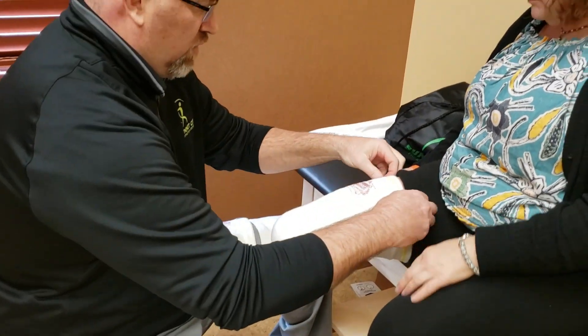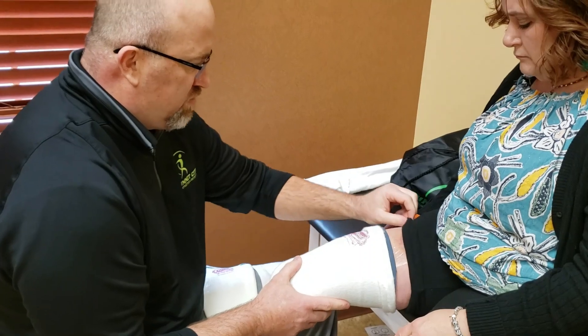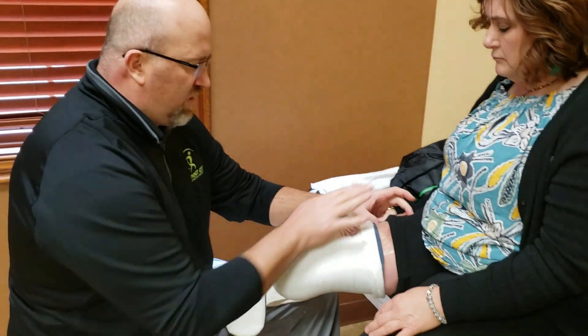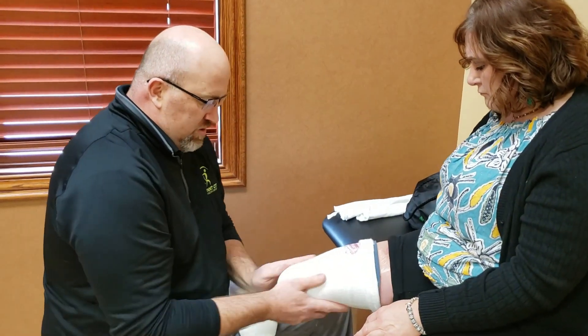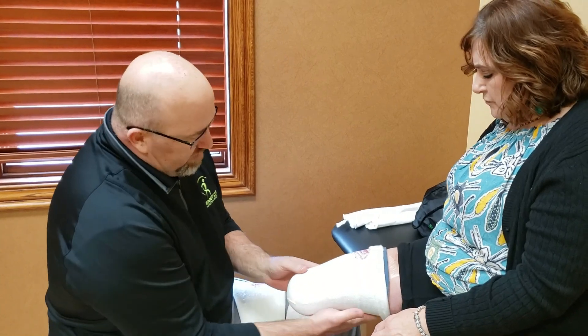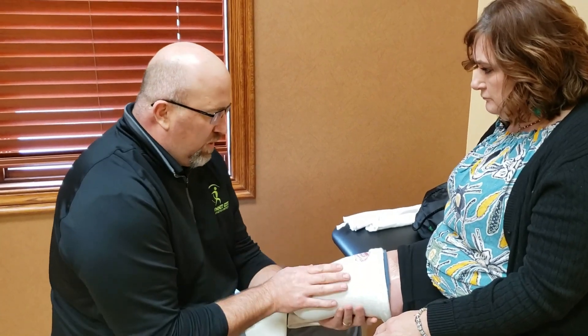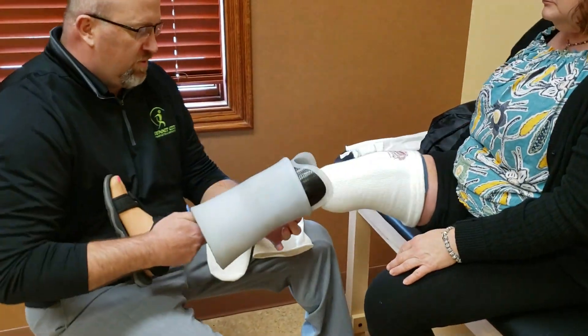This is a size wide, medium short. I'm going to recommend we reflect this down a little bit, because we want as much skin contact for the sleeve to come up and make a good sealing surface for the suction socket. We want no pleats — at the very bottom we truly strive not to have any wrinkles in the back — and then that's when we bring the prosthesis into the picture.